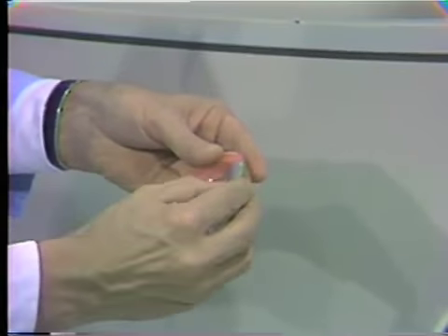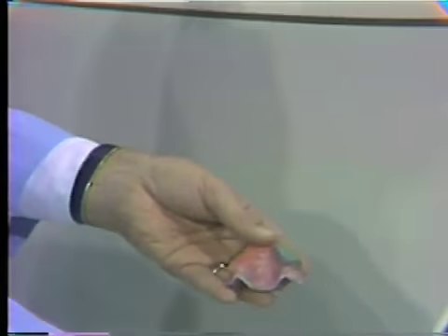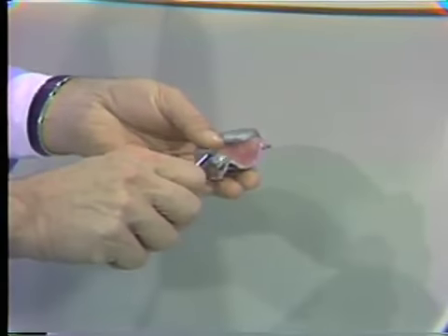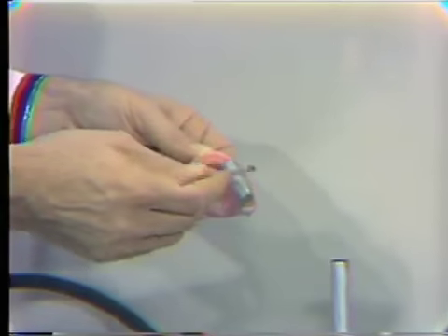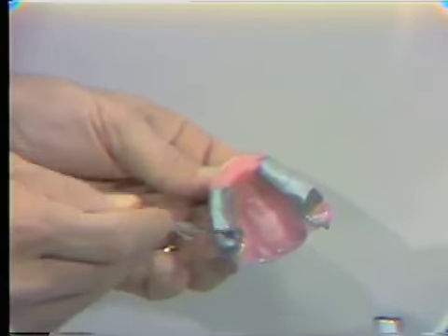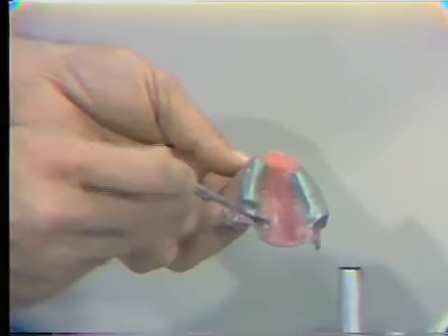As you can see, we are using a little excess on each side. We want this wax to be displaced into the grooves over the wax lower rim, and it will squeeze out on either side. Now the sealing of the soft wax is completed on both sides, and we will return to our patient.